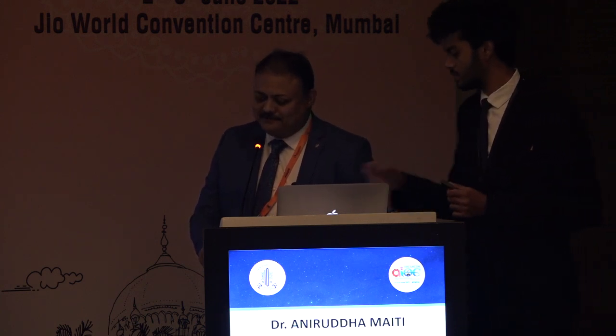And your third case, how to prevent this? You have already explained. You have to do the free island flap under PFCL. Yes, actually, there was a lack of planning. The large macular hole, I thought I will do a conventional peeling, then I decided differently.